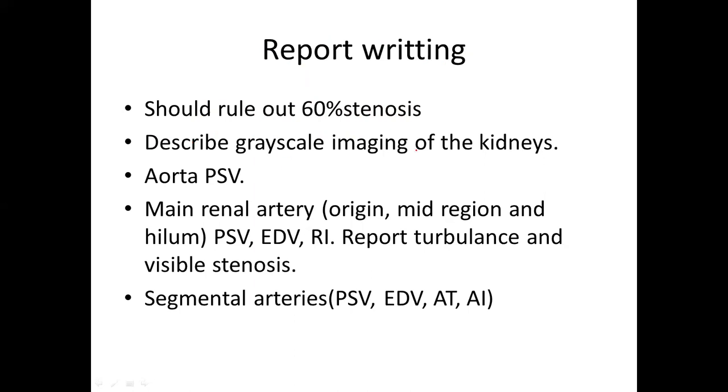You should describe the grayscale imaging of the kidneys. I think we've been talking about those echogenic kidneys. You also describe the size. Are they small? Are they large? Is there any difference between the left and the right kidney? These are some of the things that we're talking about.